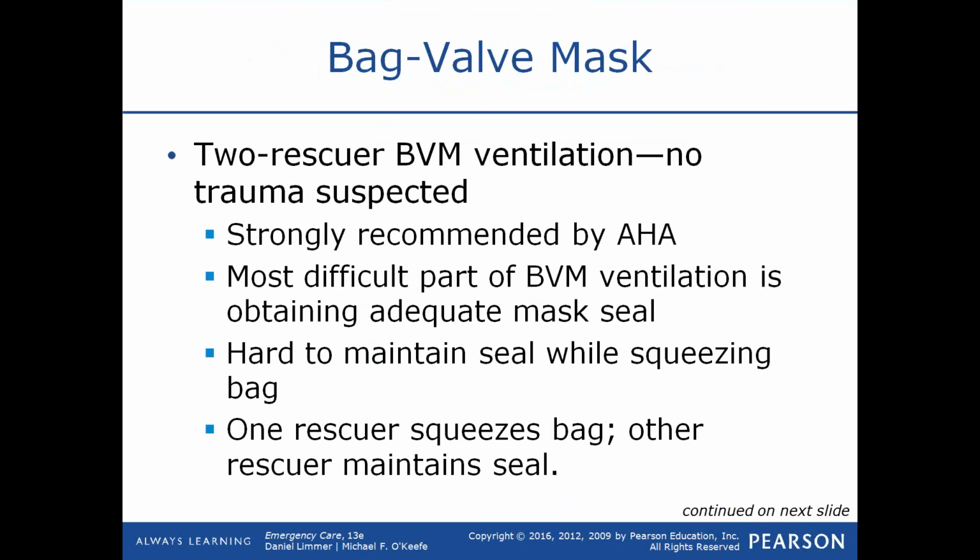That's not bouncing down the road. That's not the patient vomits. That's not facial hair. There's a lot of things that make one-person bag valve mask very difficult. So it's something that 2 people should do. So the one person maintains the airway, and the other one squeezes the bag.